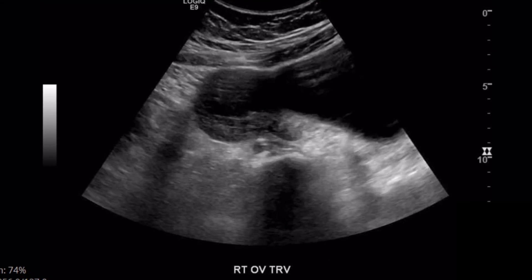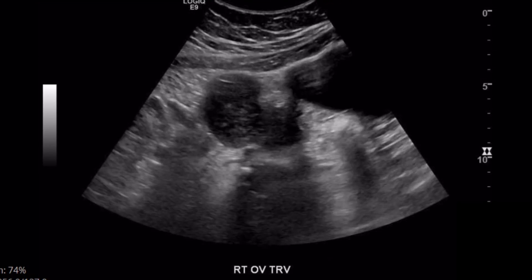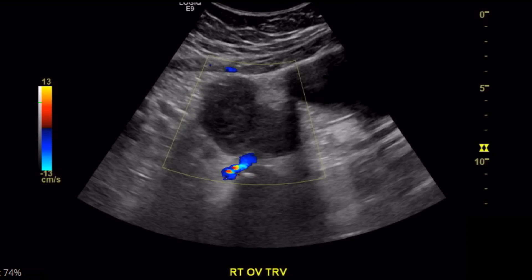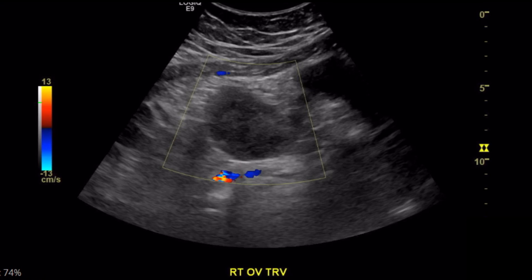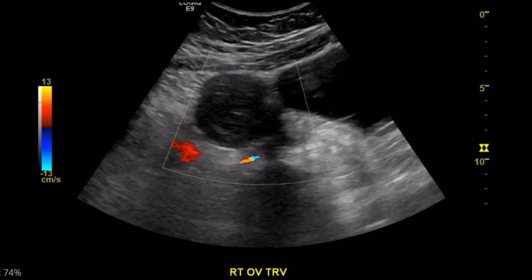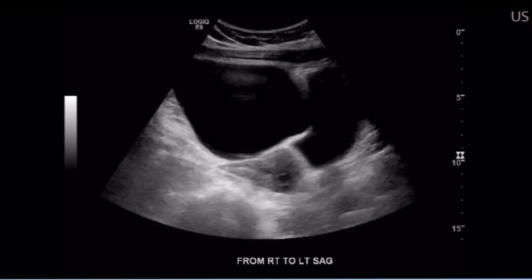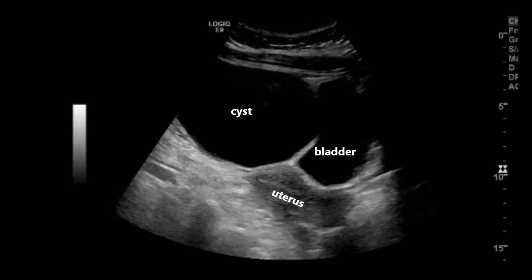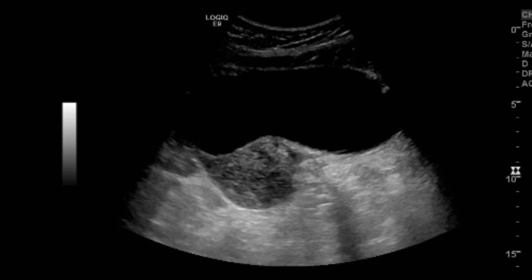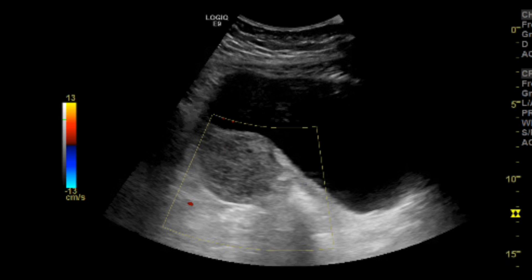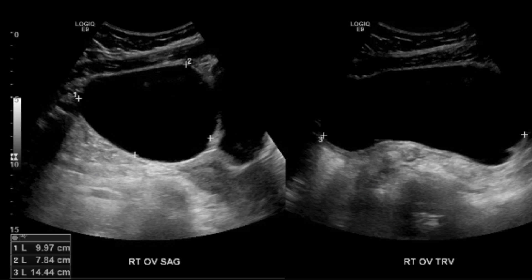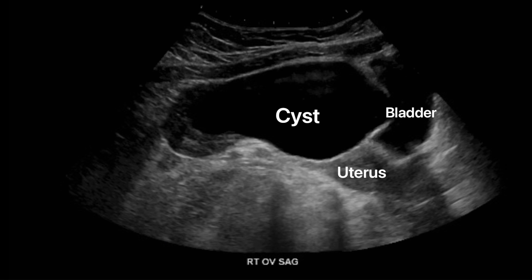Here's another example of an ovarian cyst causing torsion. A clip going through the ovary shows it is very heterogeneous, and the cyst is quite large. With color Doppler, there is no internal flow to the cyst whatsoever. Sweeping in sagittal from right to left, you can see how large the cyst is in comparison to the bladder. There's no spectral flow either. A dual screen shows the measurement, the largest being 14.4 centimeters.